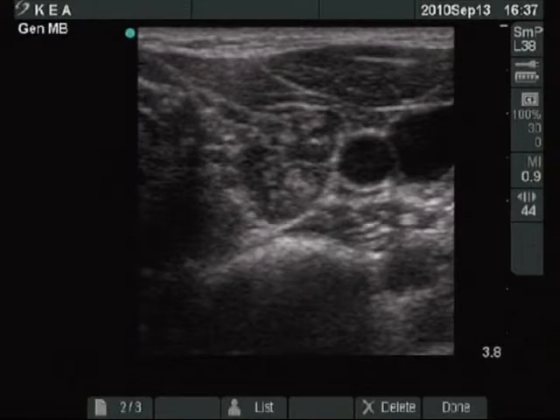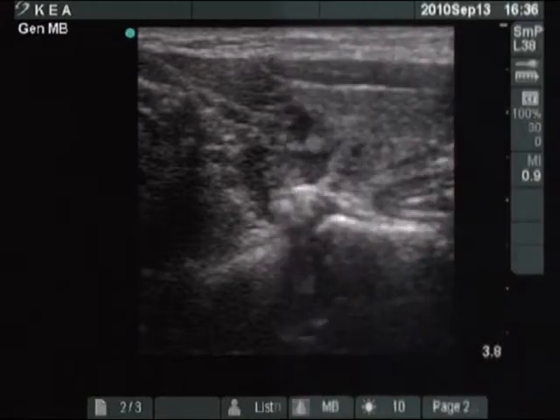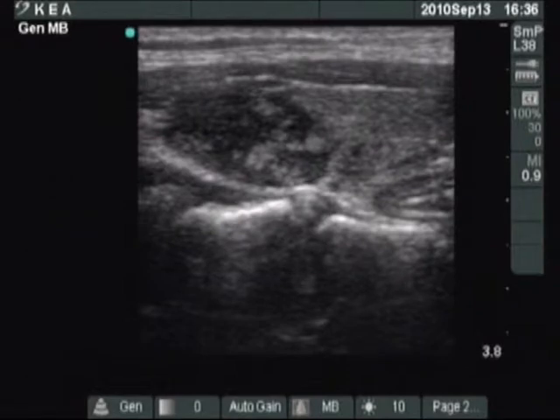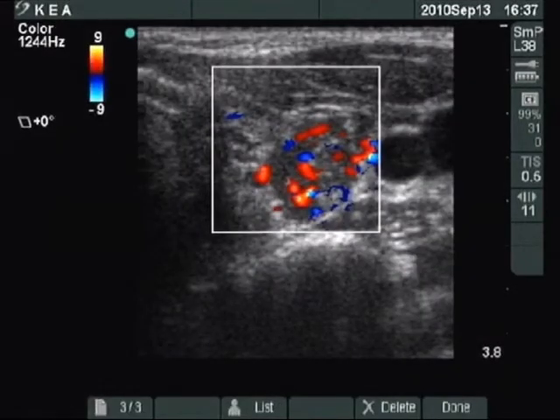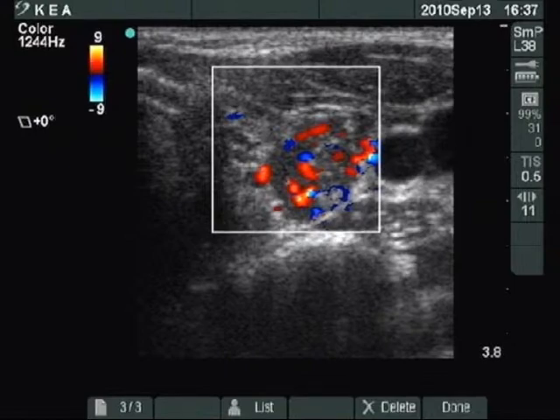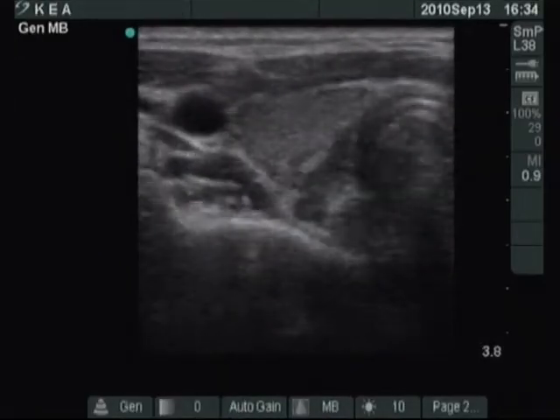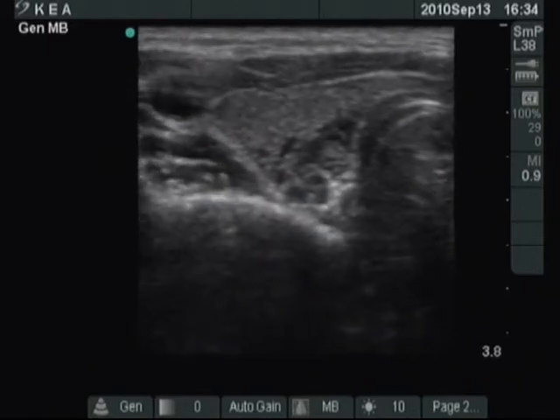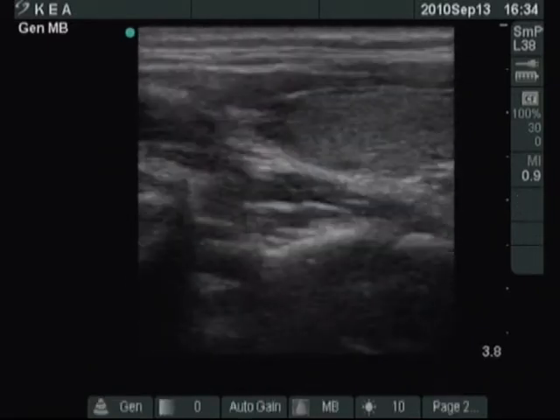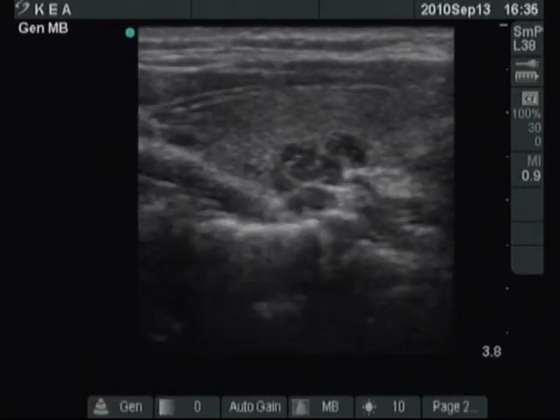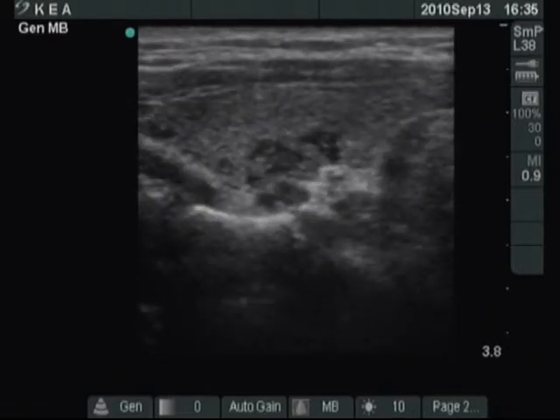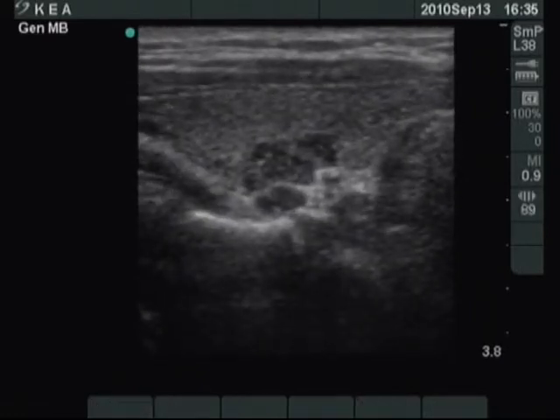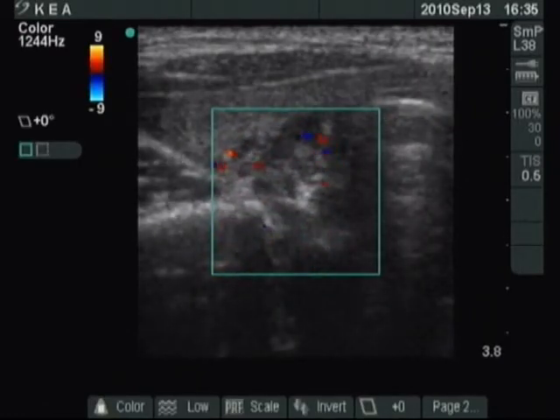A similar larger and several tiny hypoechoic areas are found in the left lobe on horizontal and longitudinal view. The intralesional blood flow is increased. The basic structure of the thyroid is isoechoic normal with the hypoechoic area, and the vascularization is decreased.